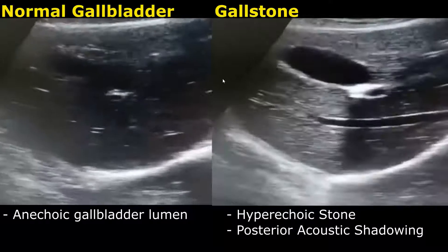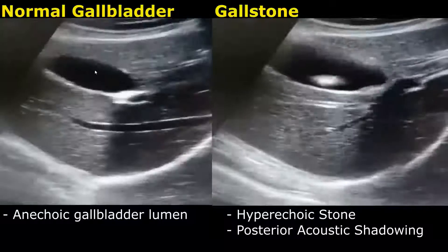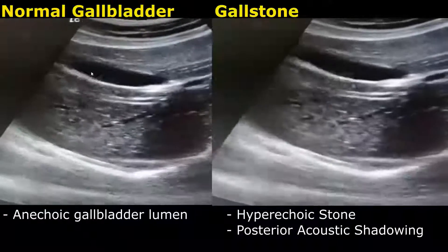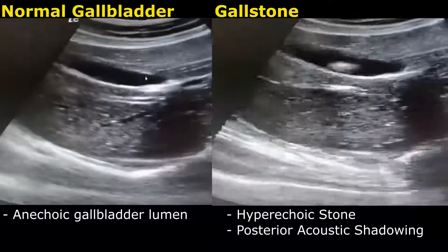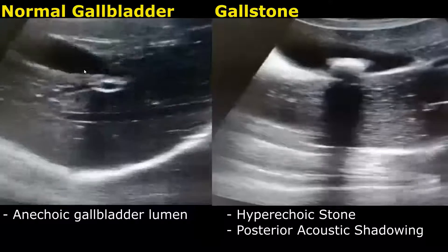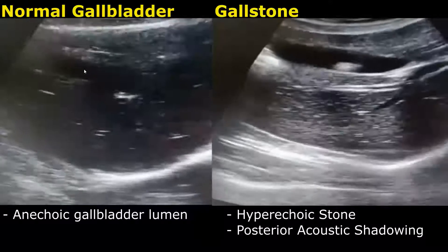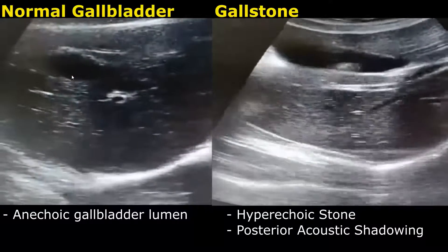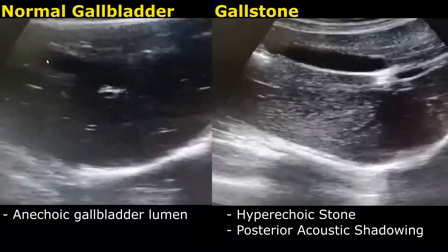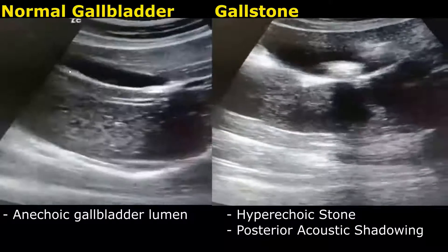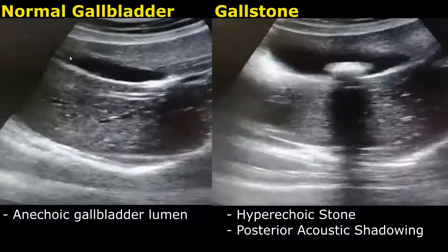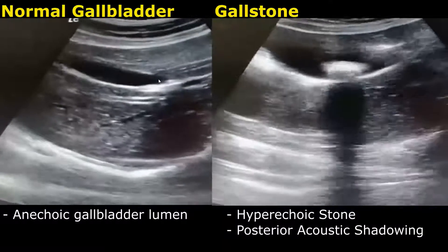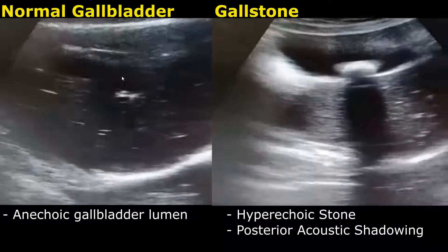In the normal image, the gallbladder has a clear anechoic lumen. The wall thickness also looks normal. The gallbladder fundus is here, towards the left side of the image, and the gallbladder neck is over here.